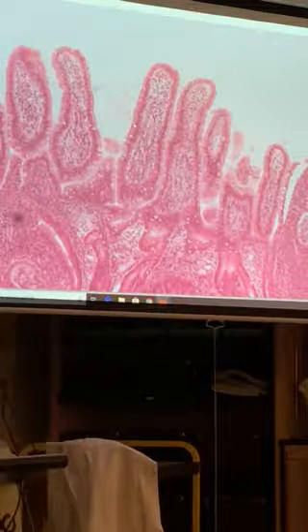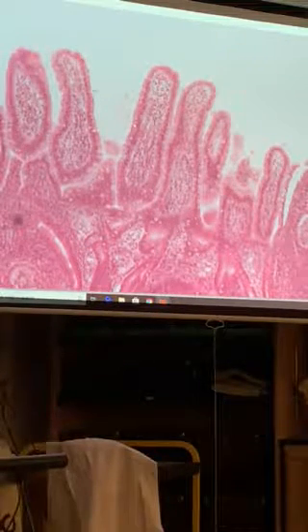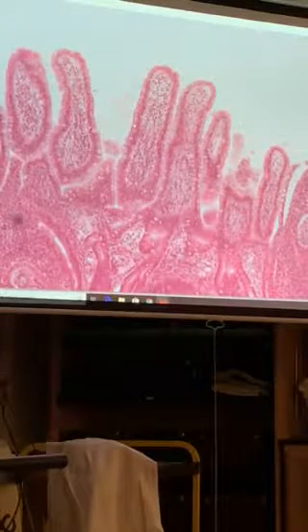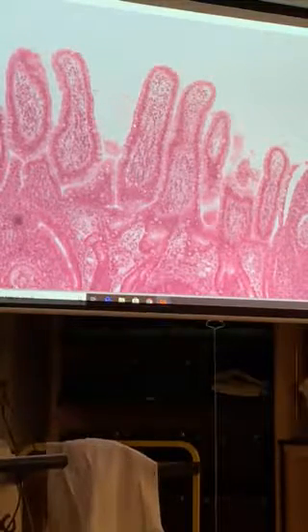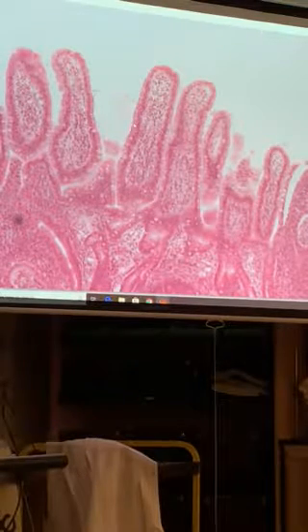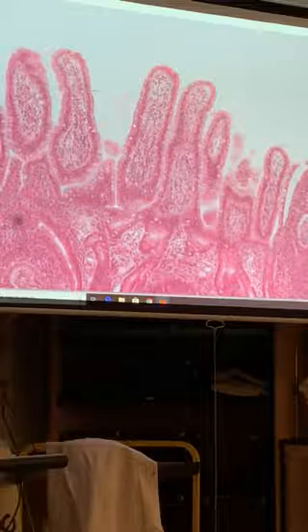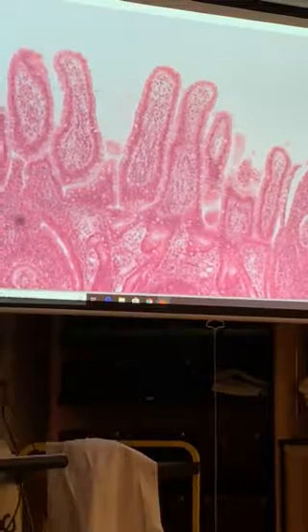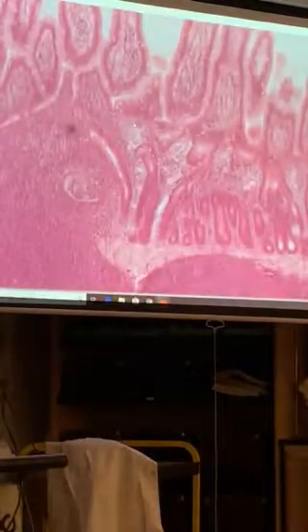Okay? All right, what's a finger-like projection called? A villus, good, or villi, it's plural. All right, we did number 14. You can see them here, the little white circles. Those are goblet cells. There's a lot of goblet cells in the ileum in particular because you're getting to the end of the small intestine. You see more goblet cells in this. I wouldn't use that as your only criteria for identifying the ileum though.